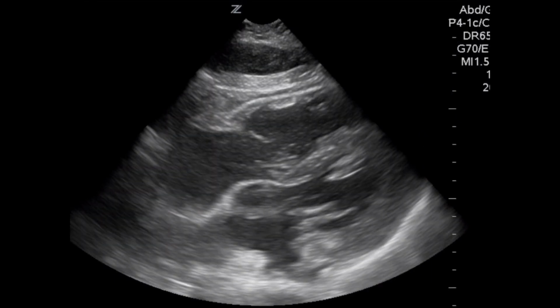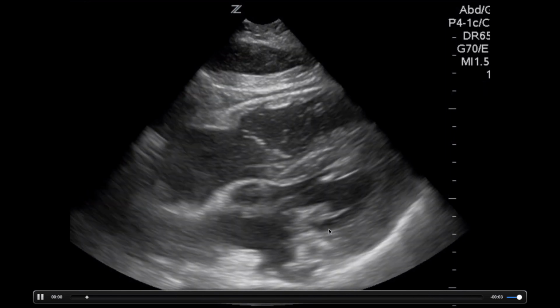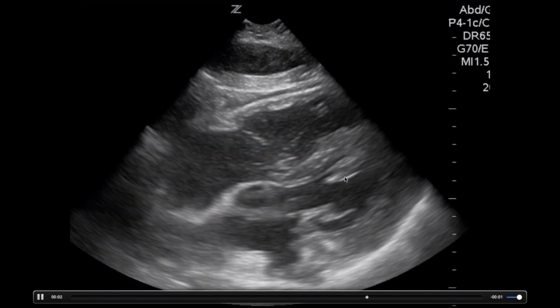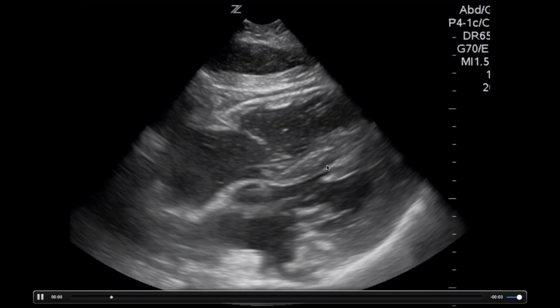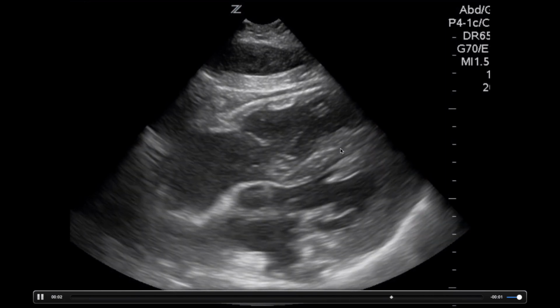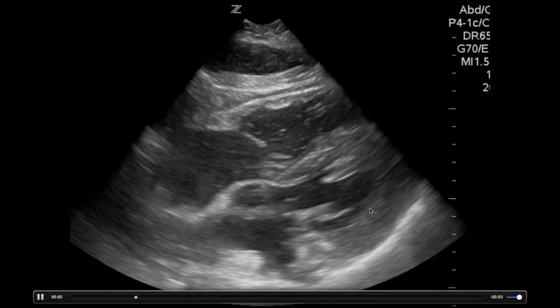Now this patient looked kind of similar to the last one. You can see a little movement of the tricuspid valve and the mitral valve. The difference here is that when I look at the muscle, I can see this quivering of the muscle. Now the question is, is it organized enough not to be called cardiac arrest? And I would call this pseudo-PEA.